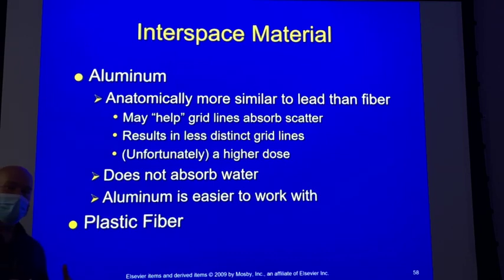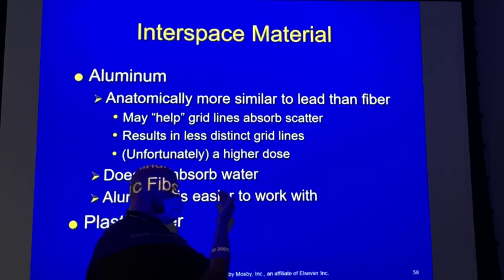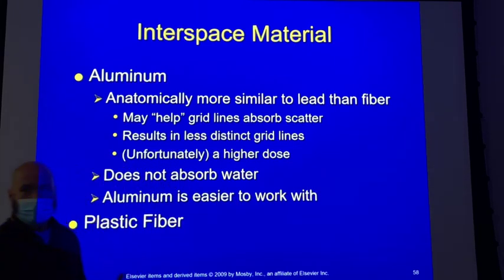So you get water or any kind of fluid down into your grid, and you've got an interspace material that absorbs water, and it's going to distort your grid lines. Instead of your grid lines being like this, they're going to curve and warp, okay? So all these pieces of lead inside are no longer like this, but they're like this, right? That's not a good thing.